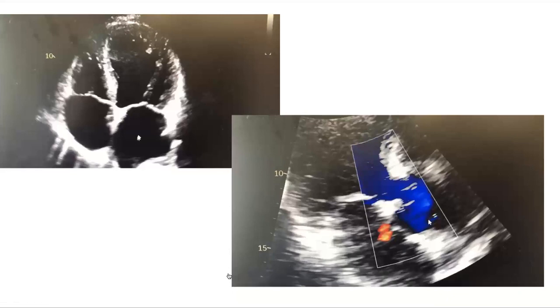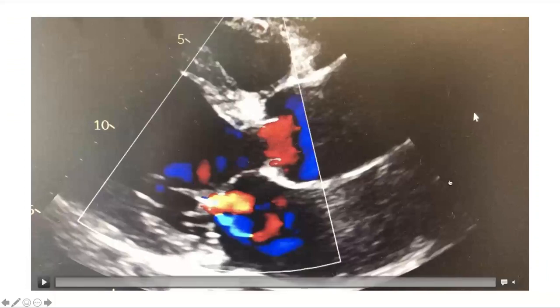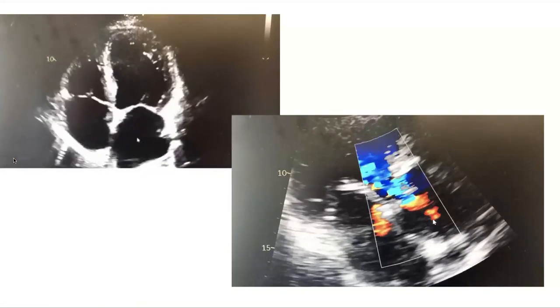And that was awesome. A lot of even the things that you mentioned, I had to learn for myself for the first time in the preparation of this presentation. So that's fantastic. But just to summarize, as Anna said, you have this enlarged left ventricle. You definitely see it, and obviously without the numbers it's hard to know, as Anna mentioned. But there's lots of loss of differentiation of the sinotubular junction. Ascending aorta looks big. The root looks big. It looks like there's almost a coaptation gap within the aortic cusps. Left atrial enlargement, and as we can even see up here, the LVEF is severely reduced.